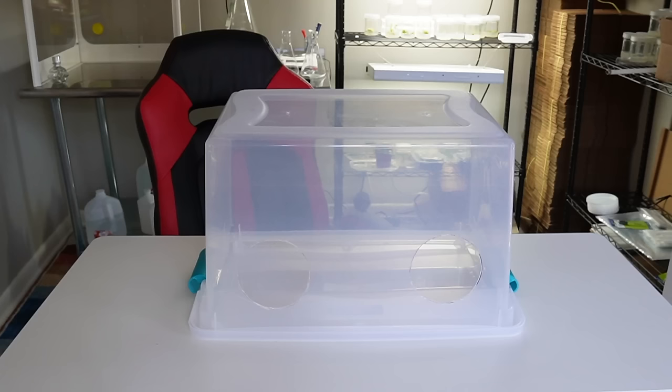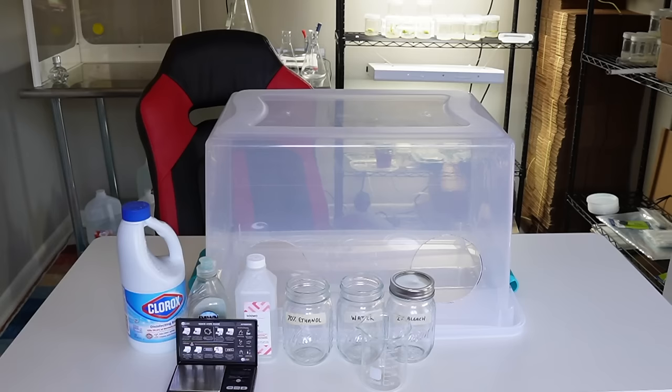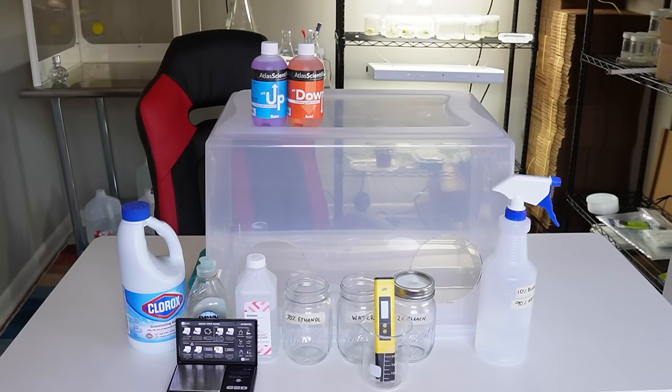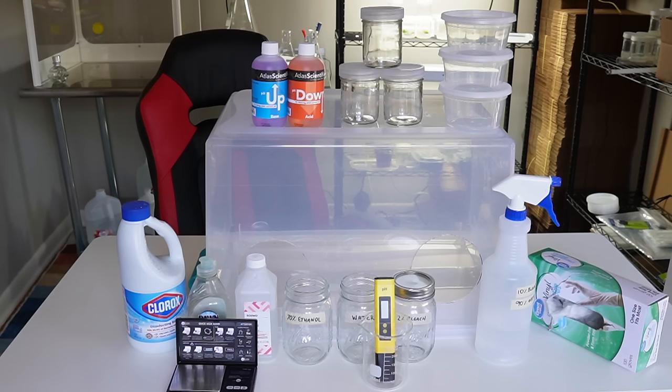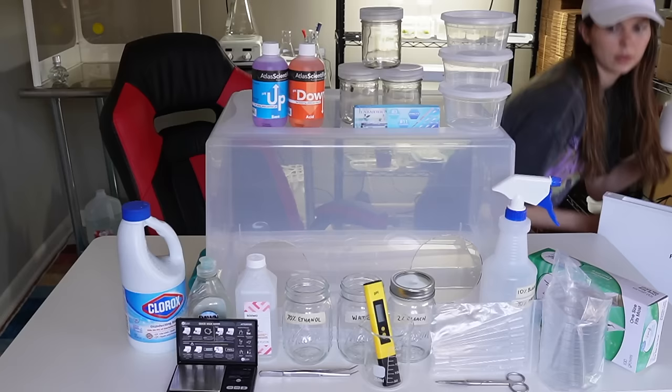In addition to the still air box, your home lab setup will also need bleach, dish soap, 70% ethanol alcohol, a few mason jars or glasses, a small kitchen scale, a pH meter, hydroponic pH up and down, a spray bottle, glass jars with polypropylene lids or polypropylene deli containers, plastic gloves, forceps, sterile petri dishes, some milliliter droppers, scissors, the ingredients to make tissue culture media which we'll discuss in part two, and a plant.